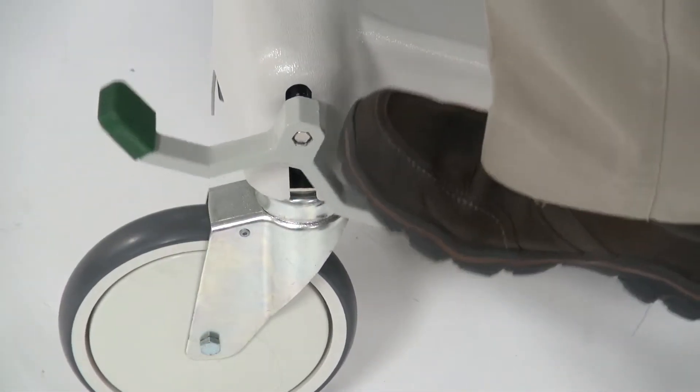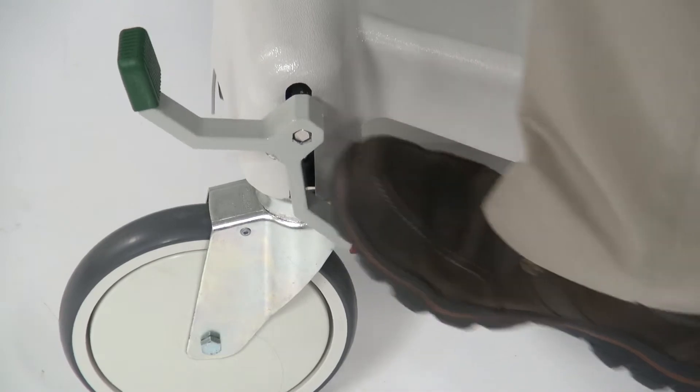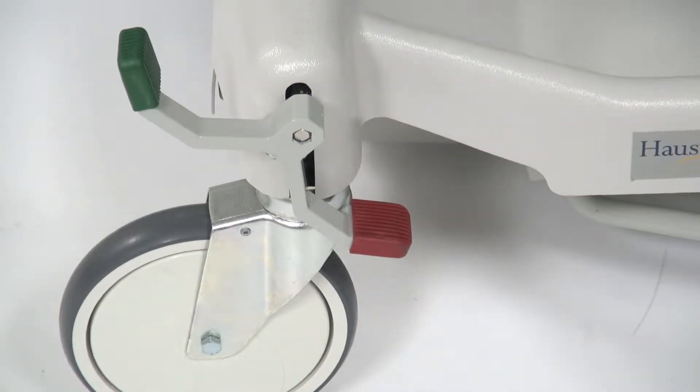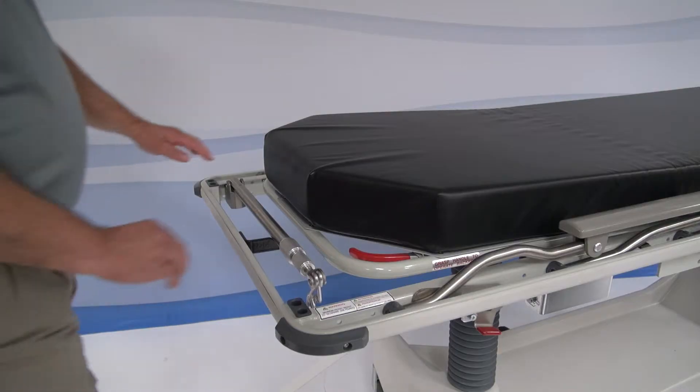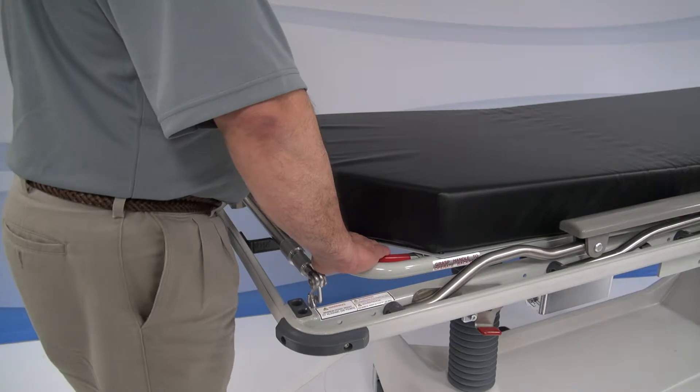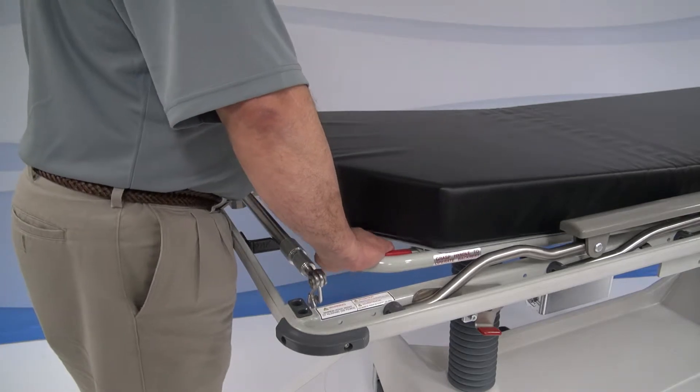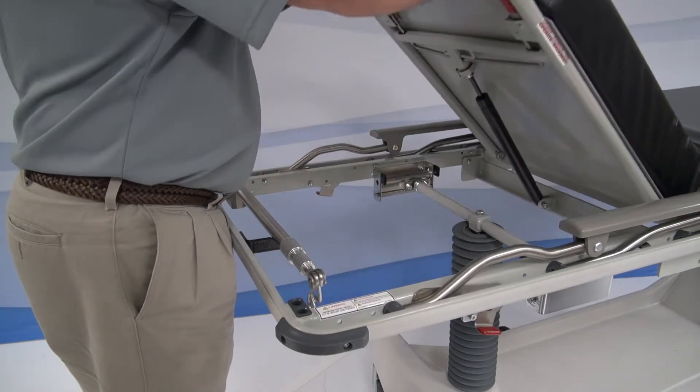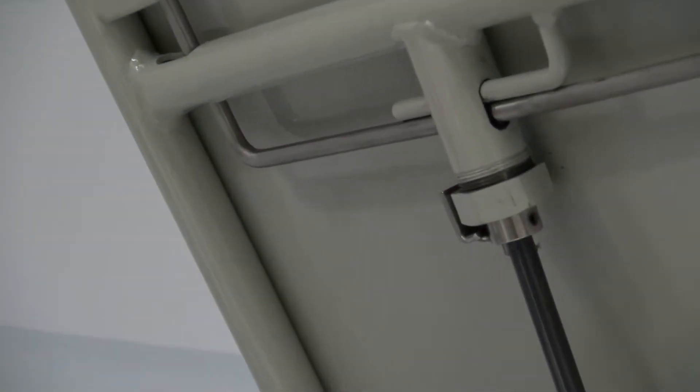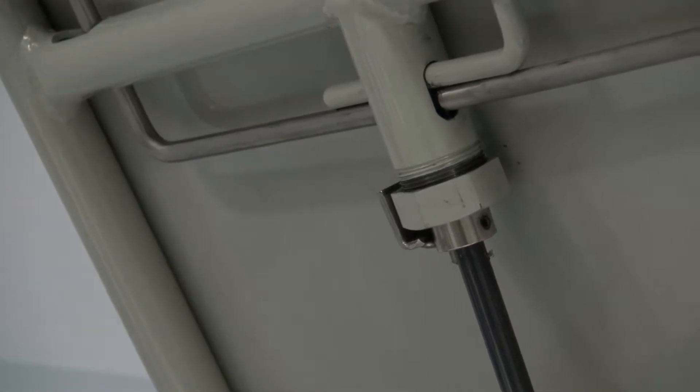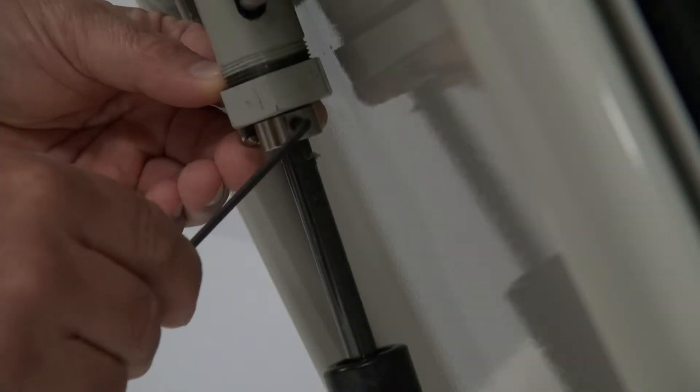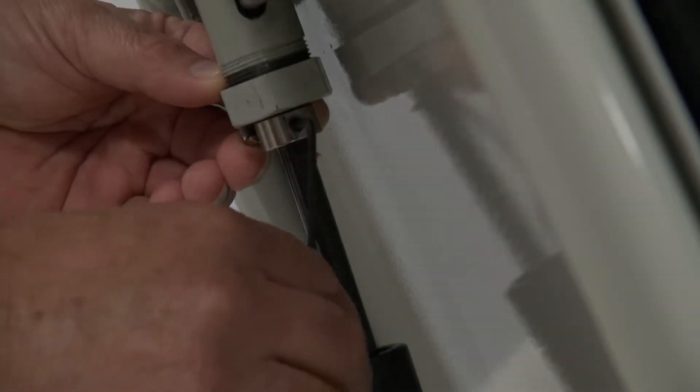To begin, lock stretcher by placing the red pedal down. Lift up Fowler. Using the Allen wrench, loosen the set screw on the stop collar and lower down.